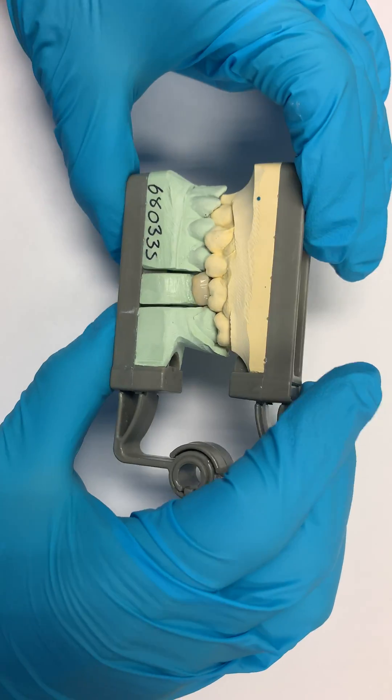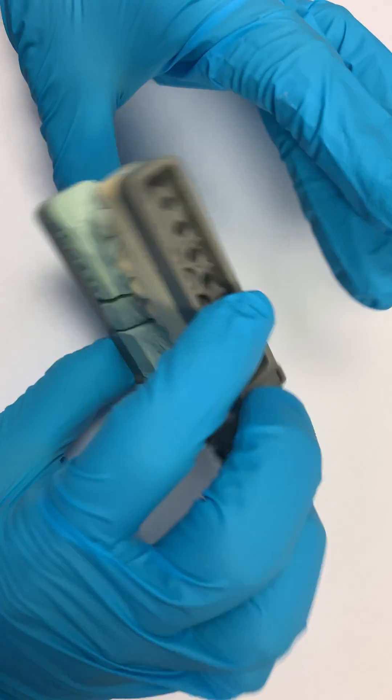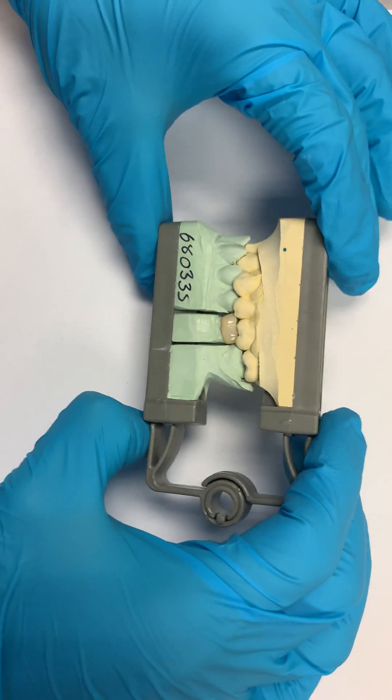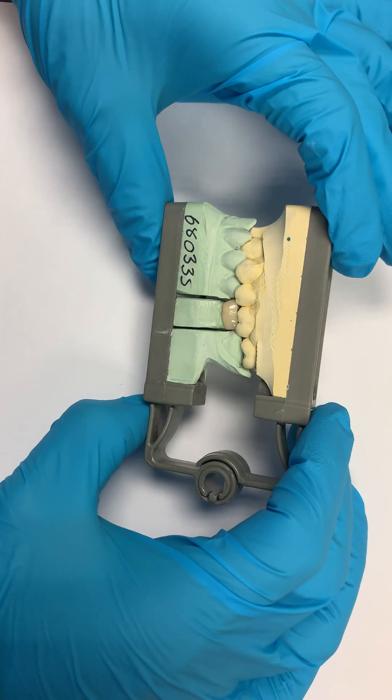The question is: what is more exact and more accurate — an impression from a triple tray or a full arch?